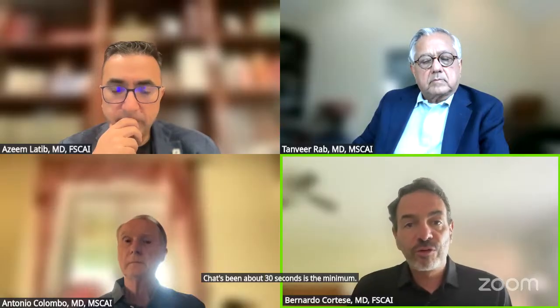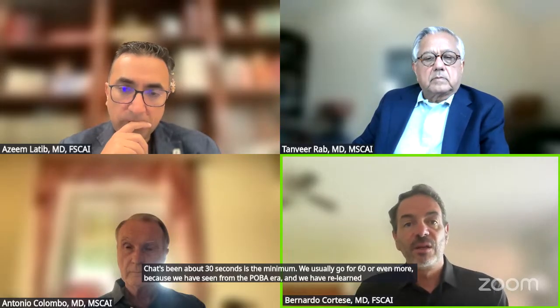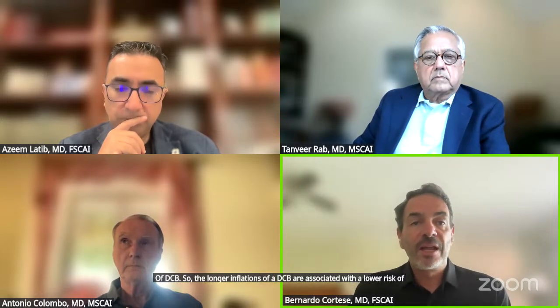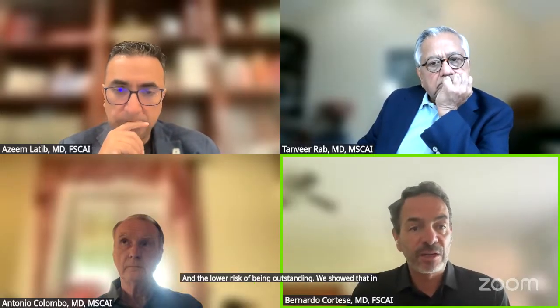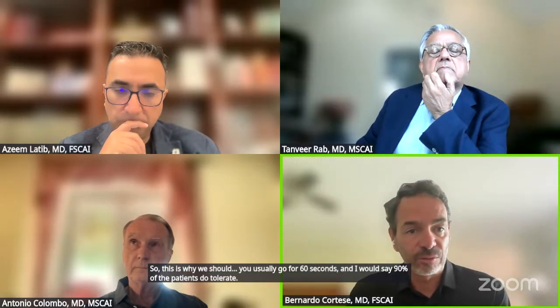We usually go for 60 seconds or even more because we have seen from the POBA era, and we have relearned with the DCB, that longer inflation is associated with a sort of scaffolding effect of DCB. So longer inflations of a DCB are associated with a lower risk of recoil and a lower risk of bailout stenting. We showed that in a sub-analysis of the ISBON study. This is why you usually go for 60 seconds, and I would say 90% of the patients do tolerate this length of inflation.